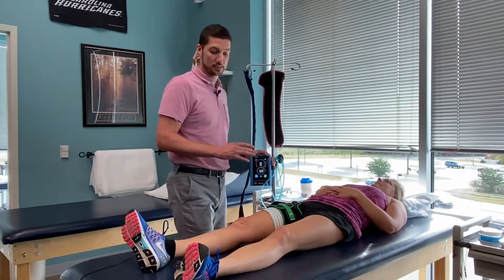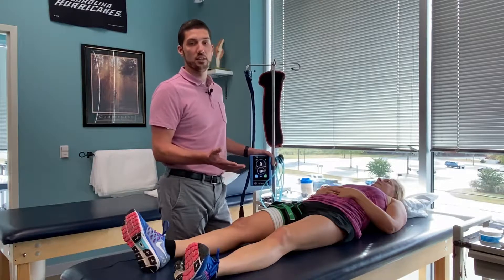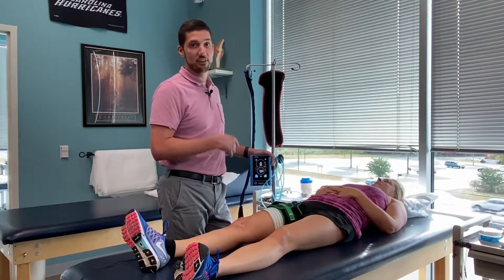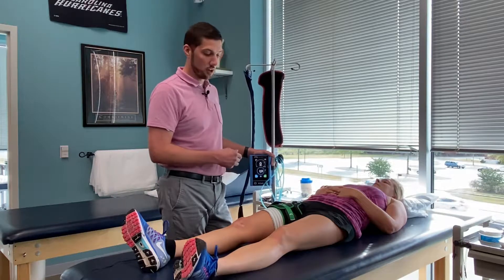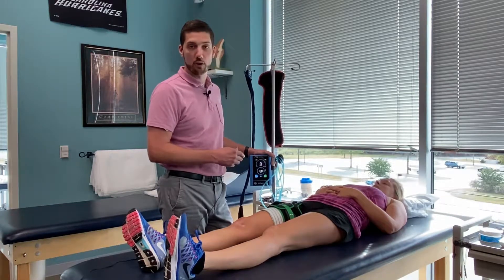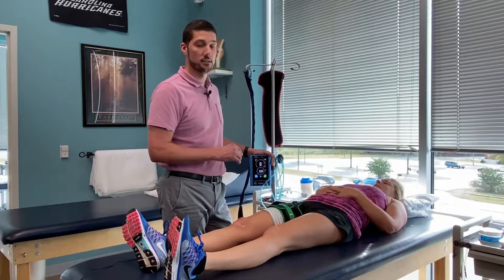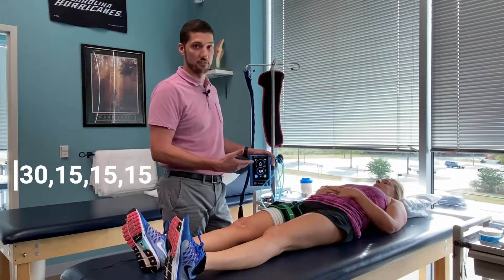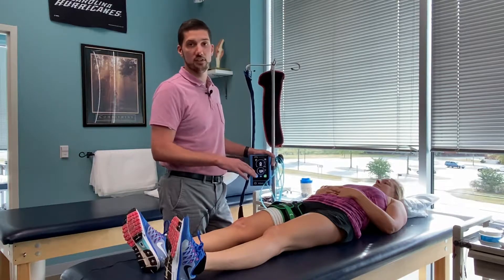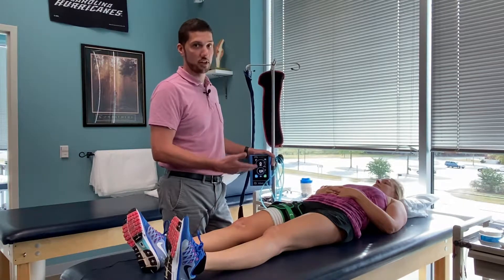Typically we'll have the individual do about three exercises directed at different muscle groups, followed by at least one functional exercise. In this case we're going to go through the typical protocol, which is four sets: the first set being 30 reps, and then 15, 15, and 15. The goal is that the individual would actually fail during that fourth set.